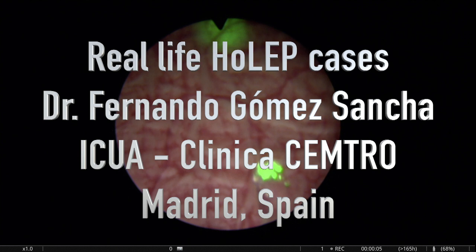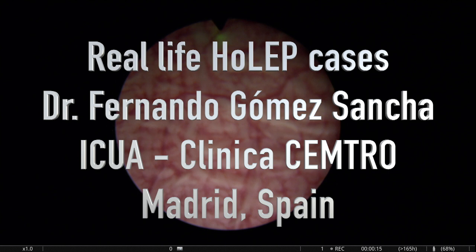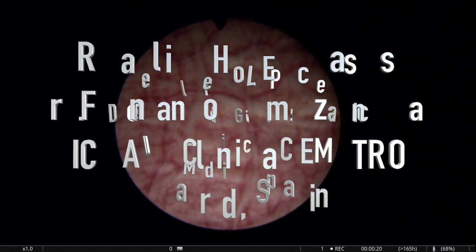Hello, this is Fernando Gomez Sancha, and this is a video of an en bloc HoLEP case that I did in Sofia, Bulgaria, with a low power laser. The first thing I noticed when I entered the fiber is that it was quite deteriorated.